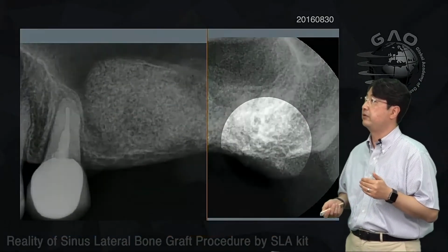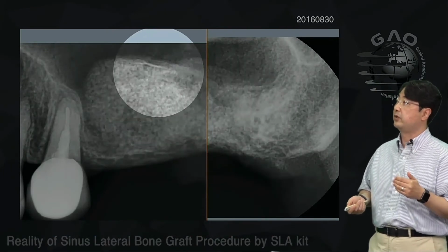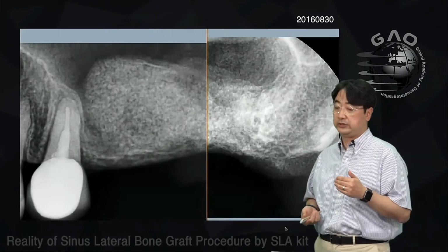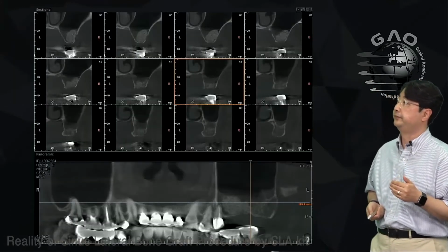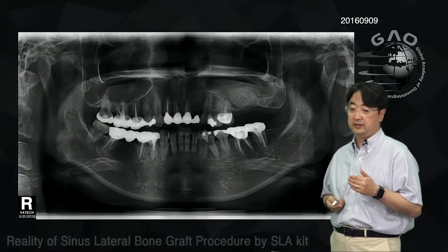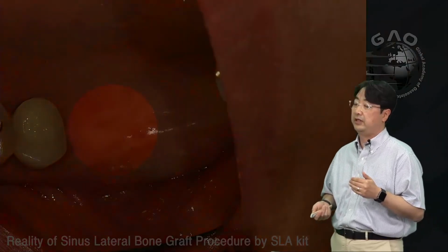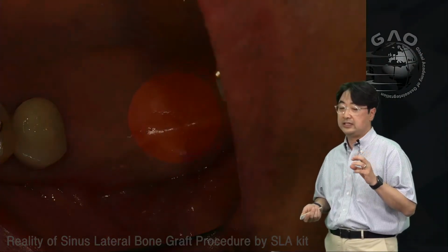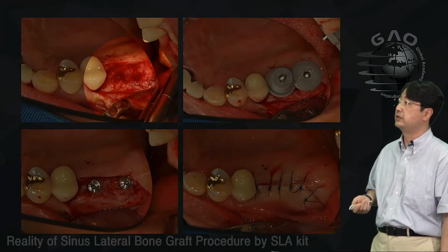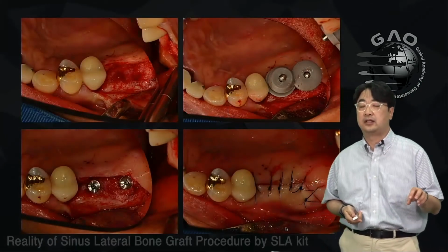And this is the periapical radiograph of this patient after the bone graft. I did the lateral approach here, and I did the crestal approach here, right? So here is where the opening was. I waited a few months, and this is how it looked after a few months. Then this is the time of re-entry, right? As you see, there was no redness anymore. Then this is how it looked after opening the wound for implant placement. And I placed 2 implants like this at the site where I did the graft.